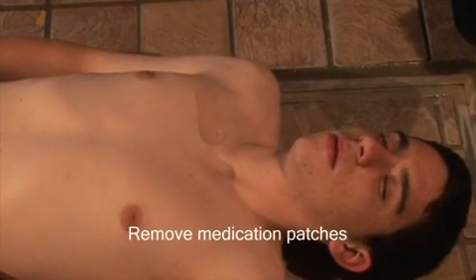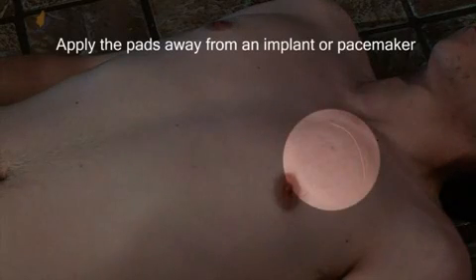Before attaching the AED electrode pads, remove any medication patches and wipe the skin clean. When exposing the chest, if you notice an implant like a pacemaker or defibrillator, apply the pads away from the implant whenever possible.